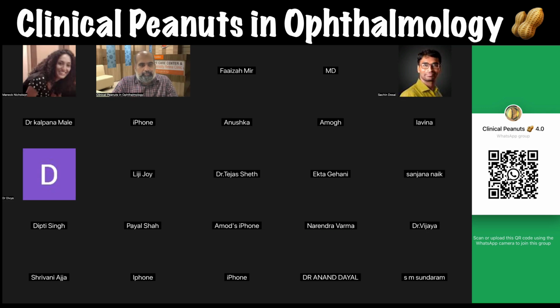The only thing is you need to rotate that toric lens into place at the end. So if you're sure that your phacoemulsification is producing good, reliable, repeatable results, and your biometry is accurate, and you're not getting crazy post-op errors in your cylinder or spherical readings, then once you've set that into motion, you should be good to go for toric lenses.